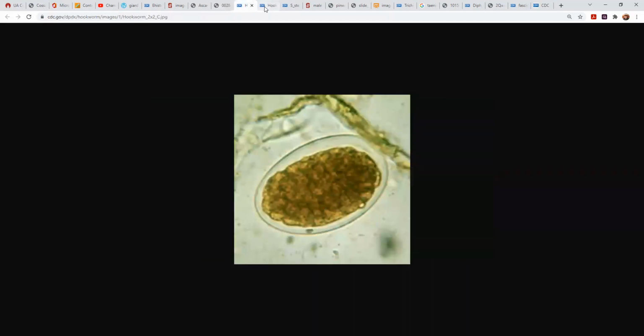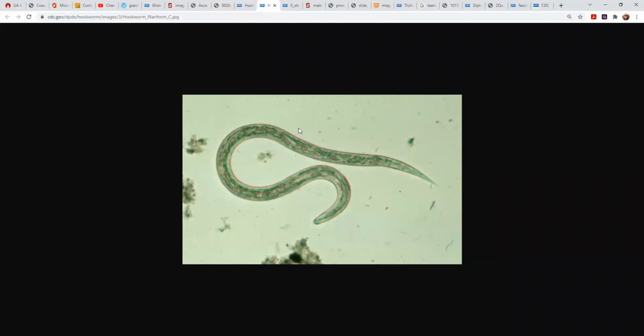And so this would be, oh, I got ahead of myself again. So this is Ancylostoma caninus. This is the dog hookworm. Again, you can see that hook structure, and then the little tail here coming almost to a point. So this would be Ancylostoma. This is actually, in your lab, it says the female, but what we're actually looking at here is a larval stage.